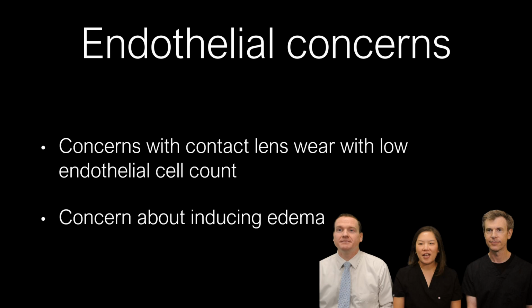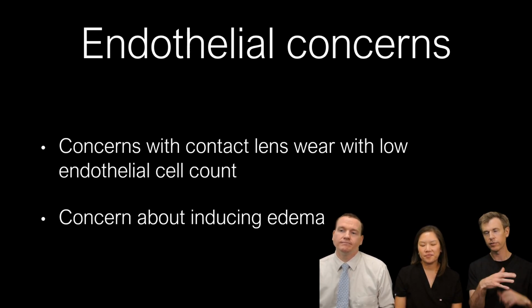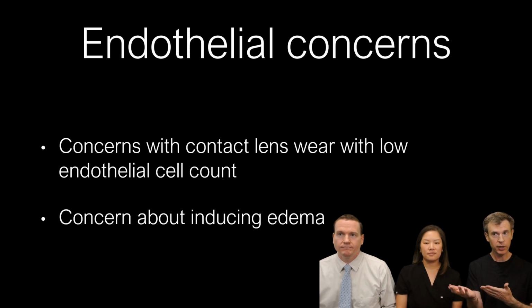So now we're talking about endothelial concerns. Concerns with contact lens wear, with low endothelial cell count, and then concerns we have about inducing edema. And the challenge is usually there is a cutoff with a lot of people who fit scleral lenses where they will not fit a scleral contact lens. The challenge with that is there are patients who don't see without a scleral lens. And yes, a scleral lens might induce edema, but it might not.